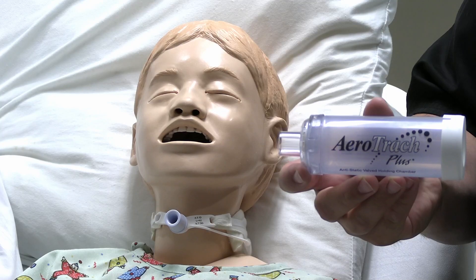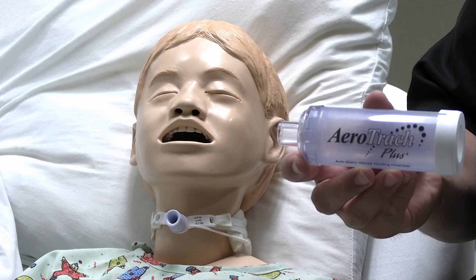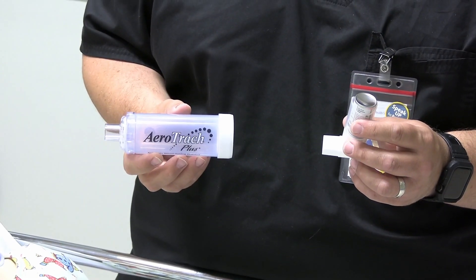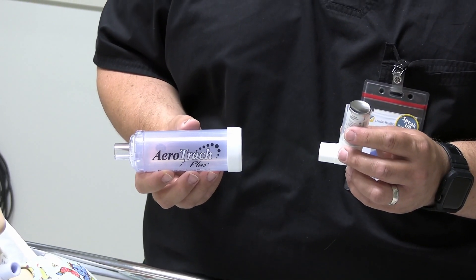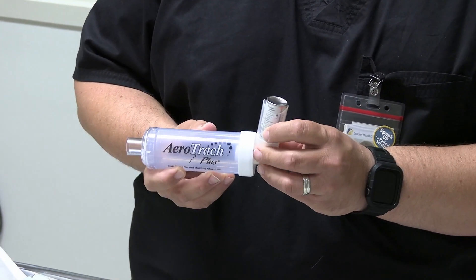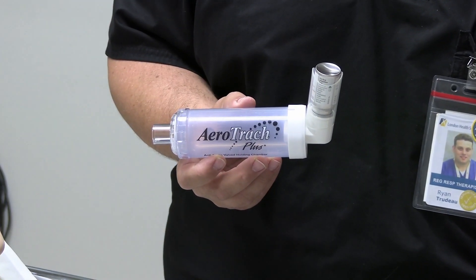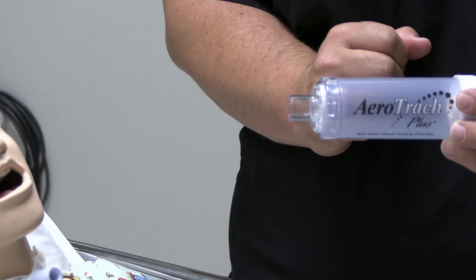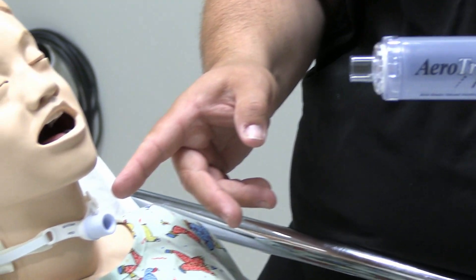Next I am going to demonstrate how to use the trach aerochamber with MDI therapy. Here I have my MDI and my aero trach for delivering MDI medication via a tracheostomy tube. I've already pre-primed and prepared my medication. I am going to insert it into the end of the aerochamber just like the previous styles of aerochamber. You will notice the 15 millimeter connector that will attach to your tracheostomy tube.